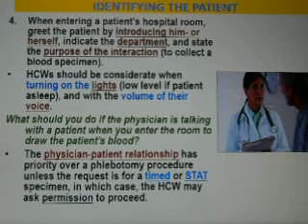So moving on to approaching, assessing, and identifying your patient. You guys know that this is something we go over and over and over again in lab class. I always say, hi, my name is Melissa. I'm here from the lab, and I'm here to draw your blood, right? The reason I'm telling you that is because out of respect for those patients, and we're delivering the best customer service we can, we always want to identify ourselves to them. Let them know who you are. Let them know where you're from and what you're there for, okay?